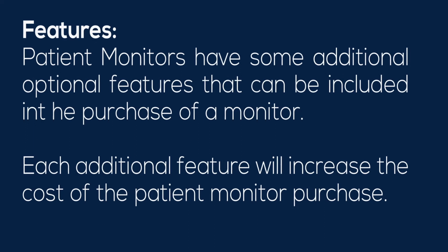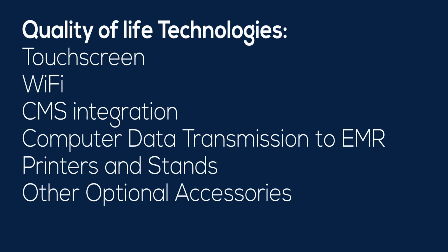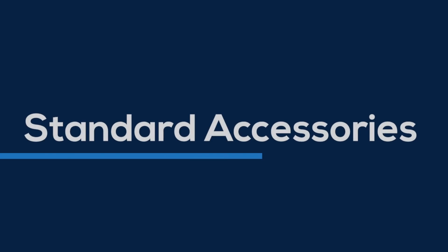Patient monitors also have the capability of having optional features that can be included at the time of purchase or after. Each additional feature will increase the cost of the baseline for the patient monitoring purchase, in exchange for quality of life technologies, such as touchscreen or wireless data transmission. Some of the other main optional features include touchscreen, Wi-Fi, CMS or central monitoring station integration, computer data transmission to an EMR, printers, stands, and other optional accessories.